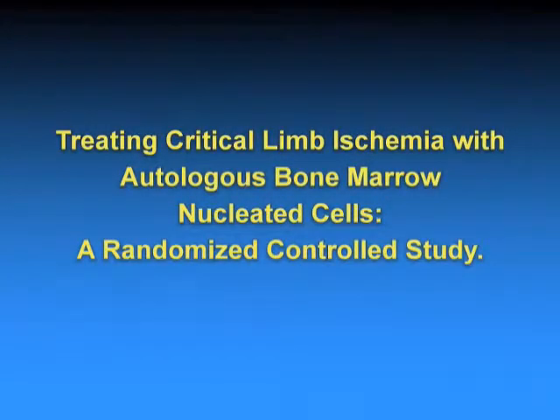This video is intended to offer information concerning the injection of a concentration of nucleated cells prepared from bone marrow aspirate as a treatment for critical limb ischemia. The video is divided into two parts.